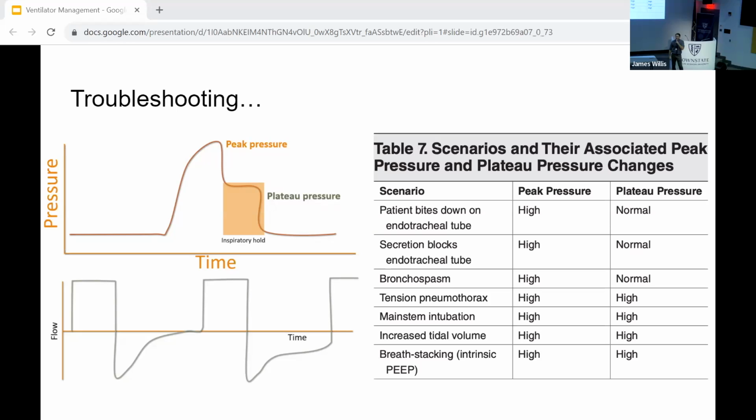All of a sudden, things get noisy because the patient is in severe distress, agitated, in pain. They're getting procedures. They have to get diagnostics. It's miserable. So then the patient starts to become interactive. And then when you go to the ventilator, it's not going to look like what I showed you because the patient is breathing over the vent. The ventilator is trying to deliver a breath while the patient, so it just causes a lot of misery. So you could use what you're able to see on those scalars to help you decide what's going on and how to respond.